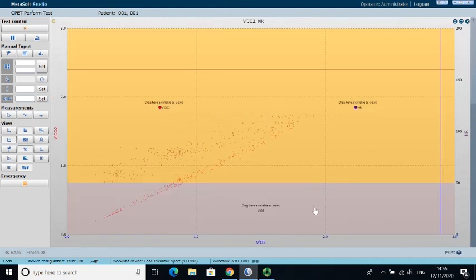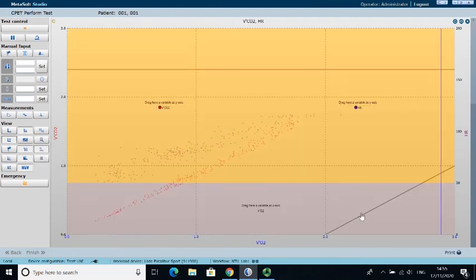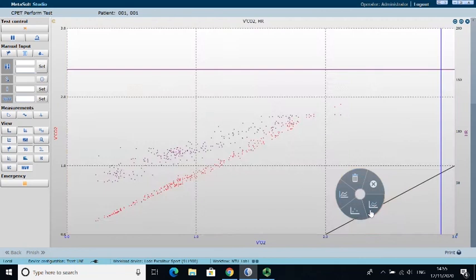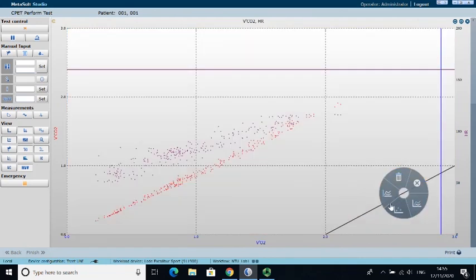Right, this is just another way of representing this relationship of oxygen consumption and CO2. You can see there's a fairly linear relationship at moderate intensity exercise between the increase in VO2 and the increase in VCO2, which is just because they're related to one another. We're utilising oxygen, we're converting the majority of it into CO2, so as VO2 goes up, so does VCO2.